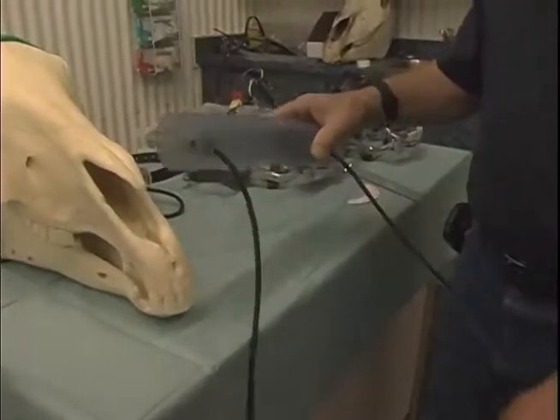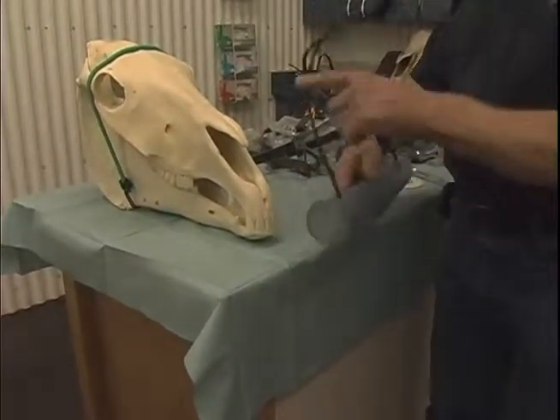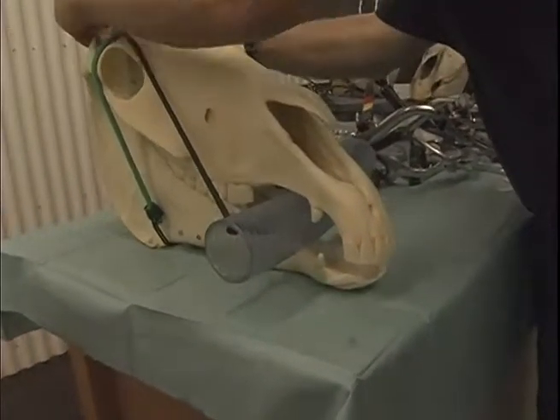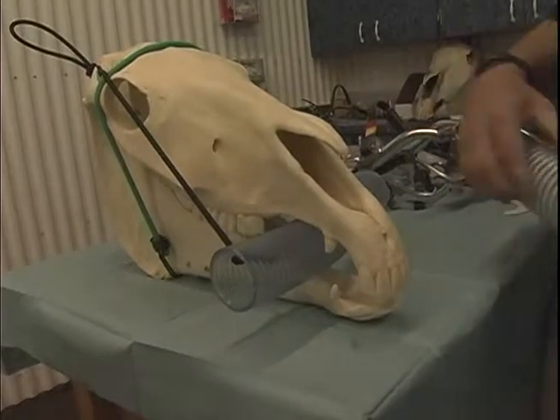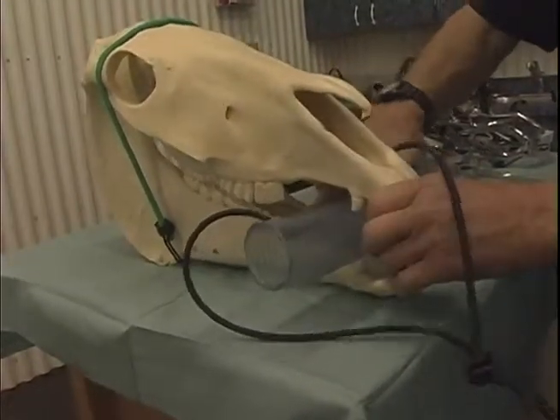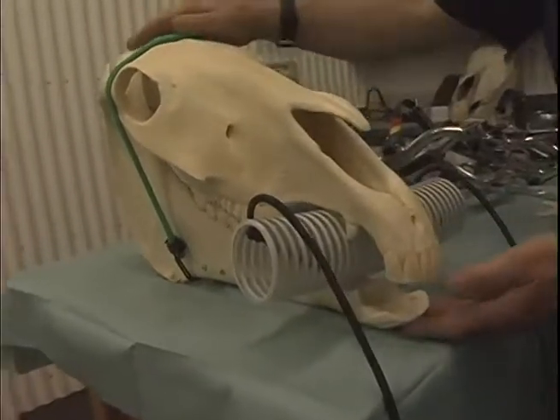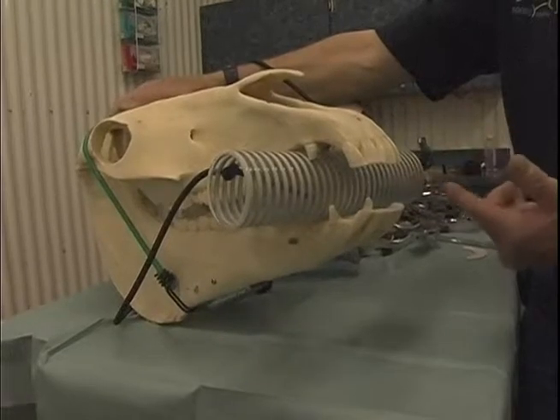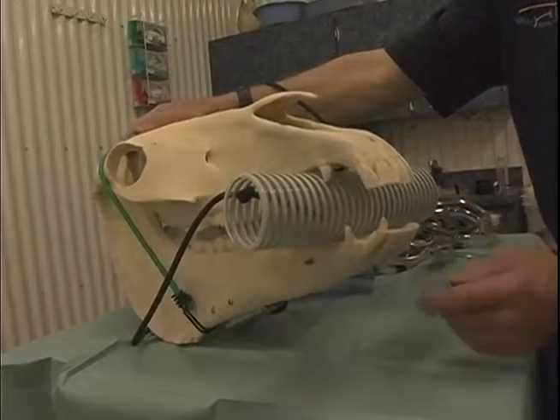In order to work on the incisor plates, we make a plastic mouth gag that will sit in the mouth in the diastema. So in order to work on the incisors, we have to keep the mouth clear of any bite plates. So this is a plastic speculum for smaller horses, and we also have a larger plastic mouth gag for big horses. The placement of this gag in the mouth will allow a person to take off hooks and diagonal bites and smiles from abnormal incisor malocclusion situations.